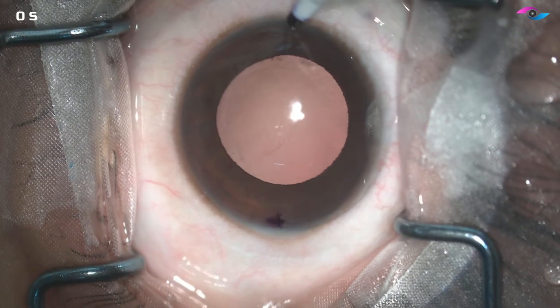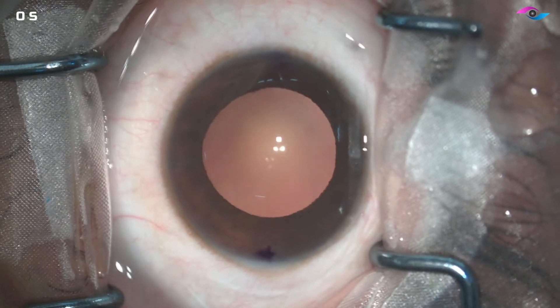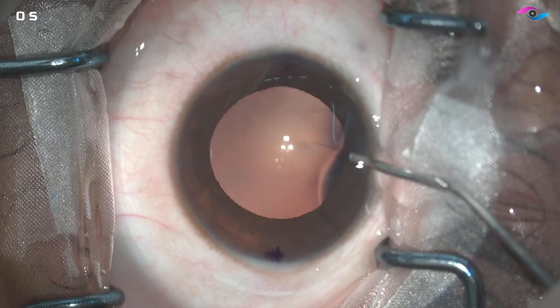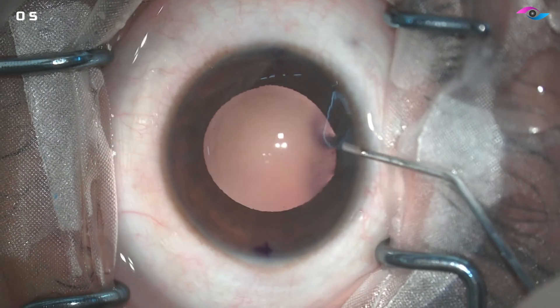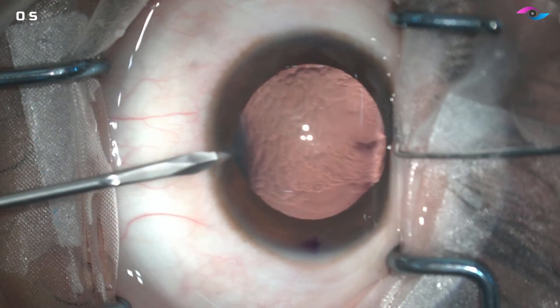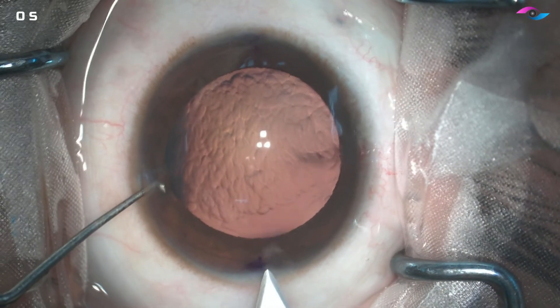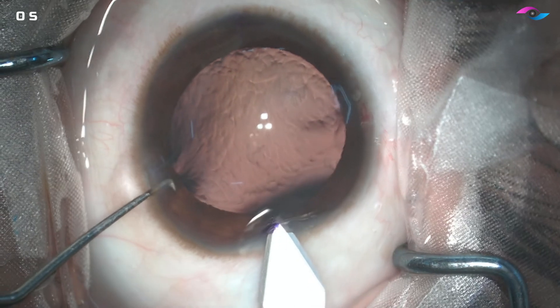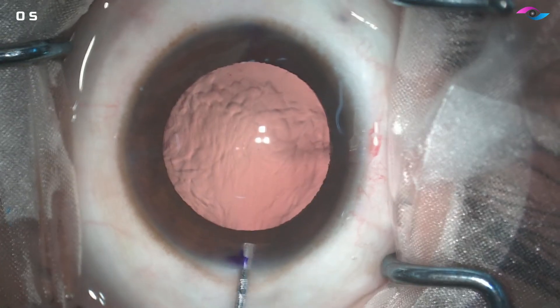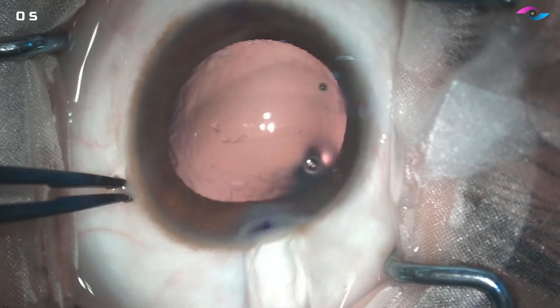I first like to use the chopper and then the marking pen. One side port is created and we inject a little bit of lignocaine along with adrenaline to anesthetize the eye from inside. Then we place some viscoelastic — avoid overfilling the eye, just enough so that the chains of the viscoelastic are visible. Then we make another side port and a main port incision. We need at least 3 to 3.2 mm incision to insert the ICL comfortably, then inject a little bit of viscoelastic again, avoiding overfilling.